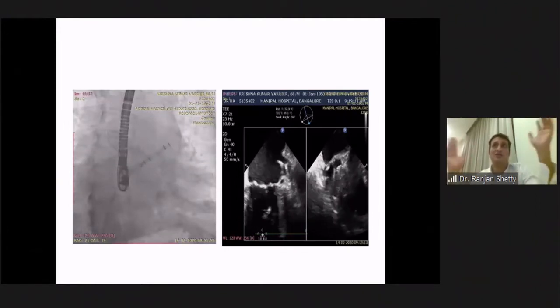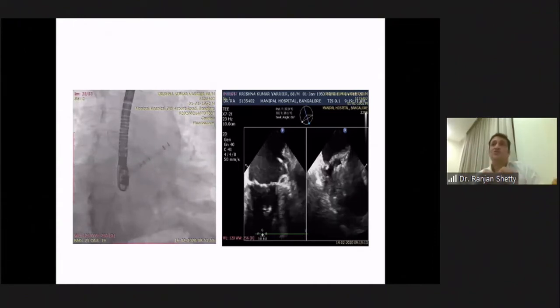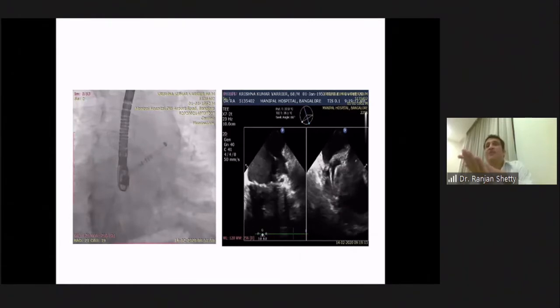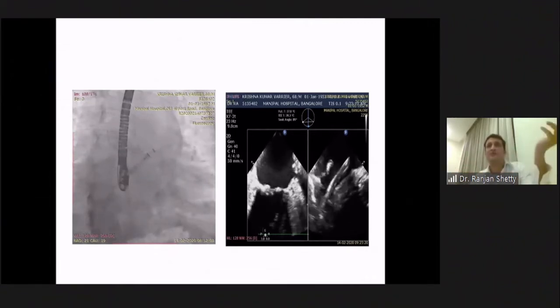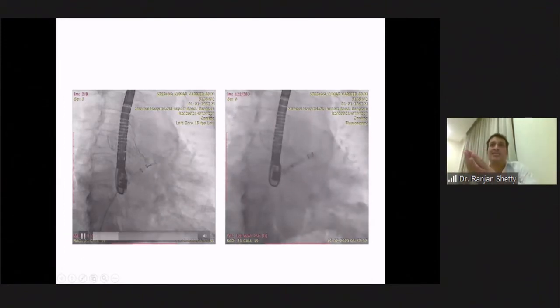It has to be anti-clockwise, because the device has a tendency to fall back into the left atrial appendage and align itself in a funny way. So to align it properly, we need to be in the topmost, outermost lobe, and complete anti-clockwise is needed. At this point, we start withdrawing the device. This is typical unsheathing, like what we do in an ASD. Both sheaths are acting like one system, and we start withdrawing.